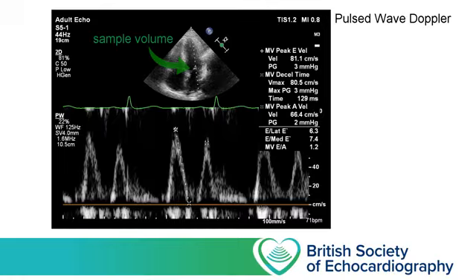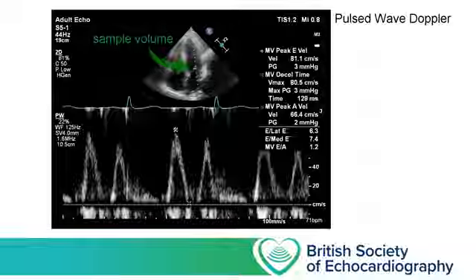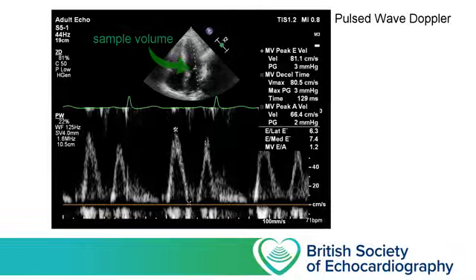Now, we won't be using spectral Doppler as part of our level 1 scans. However, as we'll see in a minute, this technique of sending out a pulse of ultrasound and then gating the response to isolate a specific region of interest is the technique that the ultrasound software will use to generate colour maps for us. So I think there's some merit in understanding how this is done, and it will allow us to go on and discuss some of the strengths and limitations of this technique.